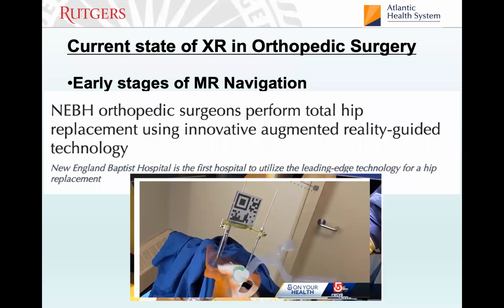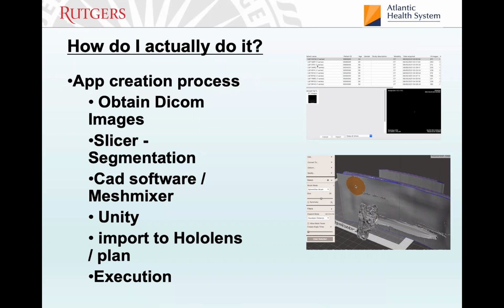That is something that is very well done by technology. Augmented reality and mixed reality options, when picking up a QR code like that, can project an image very, very accurately. But looking at the edges of a screen or some other model that's not very specific, they're not as good. So this is a really nice way to do it, but I think it works because of the other tool that he has. I'll be curious to see how this plays out in the future, but it's another example of how it's not just shoulder surgery or difficult tumor cases; you can really use this tool for lots of different orthopedic cases.